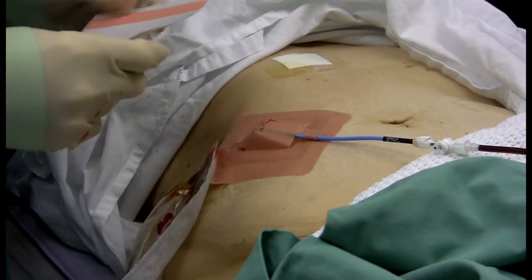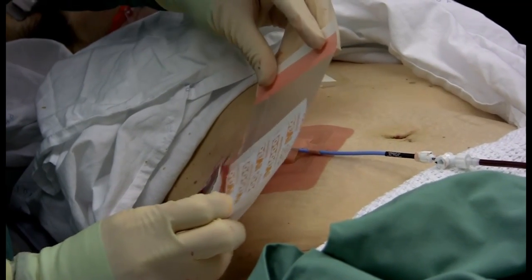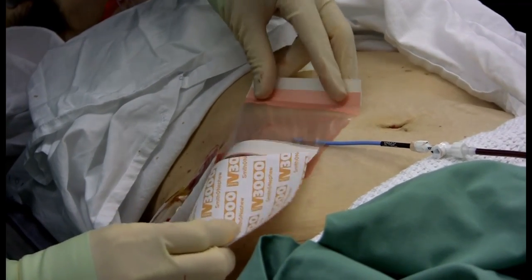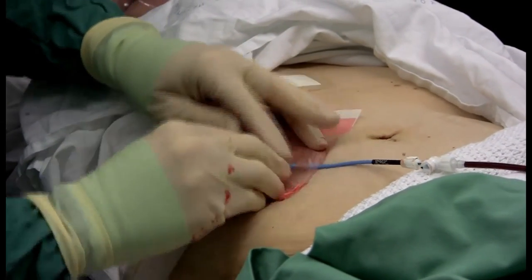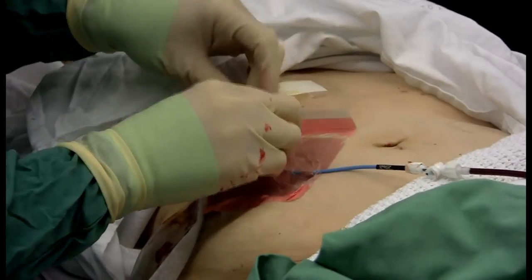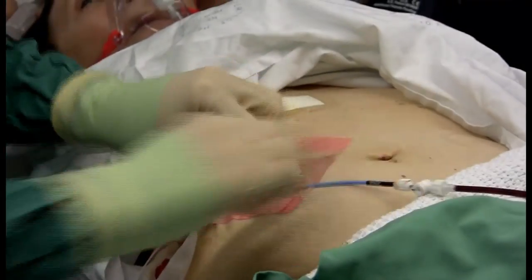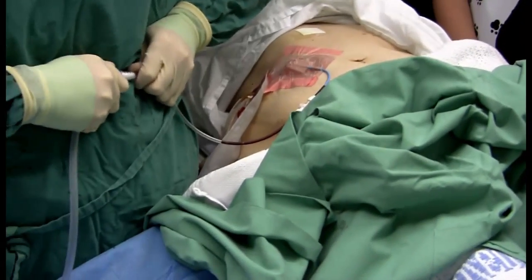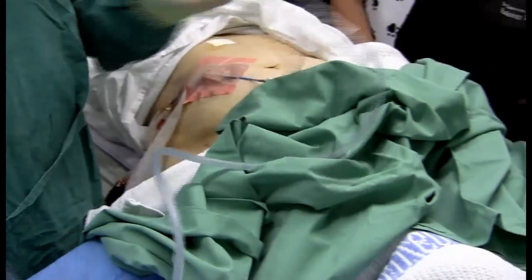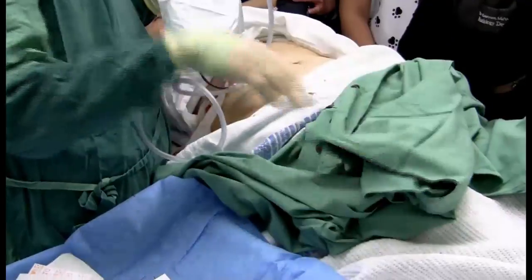We use a Smith & Nephew IV 3000 — a gas-permeable but waterproof dressing — lining up the crease in the middle on the middle of the drain fix. It's a bit crowded here with the stoma bag in place, but we get everything to sit how we'd like it. Attach a drainage bag to the end, nice and firmly, and check that the tap is not open — because if it ships with the tap open, as soon as you attach the drainage bag it starts spilling contents all over the floor. And we're all done.